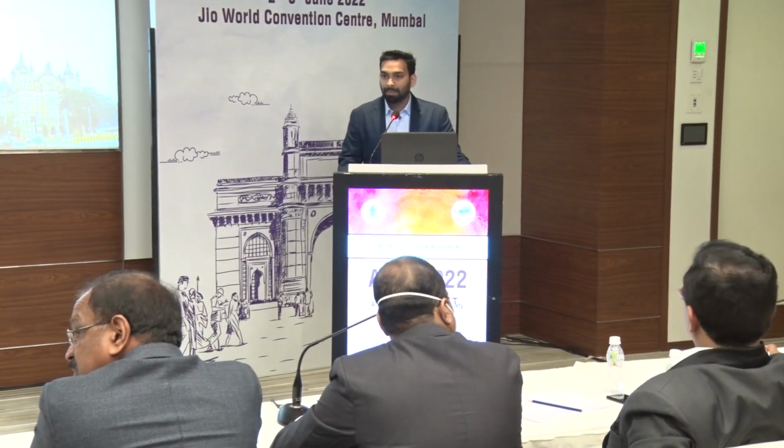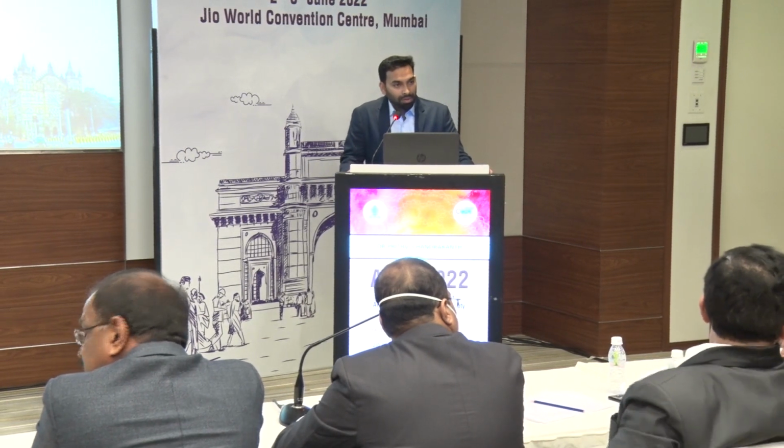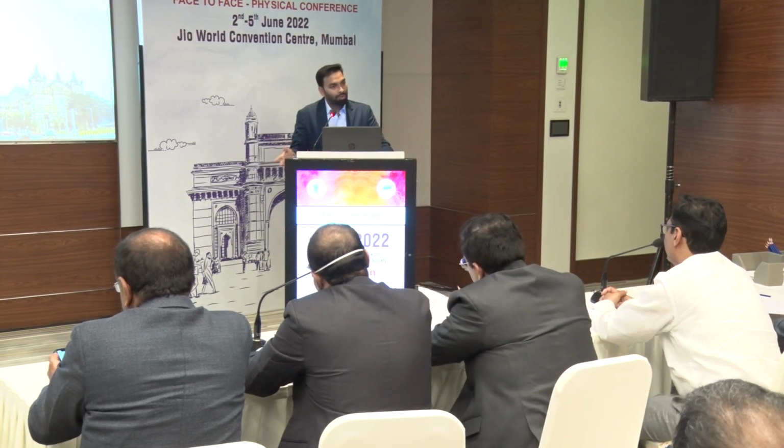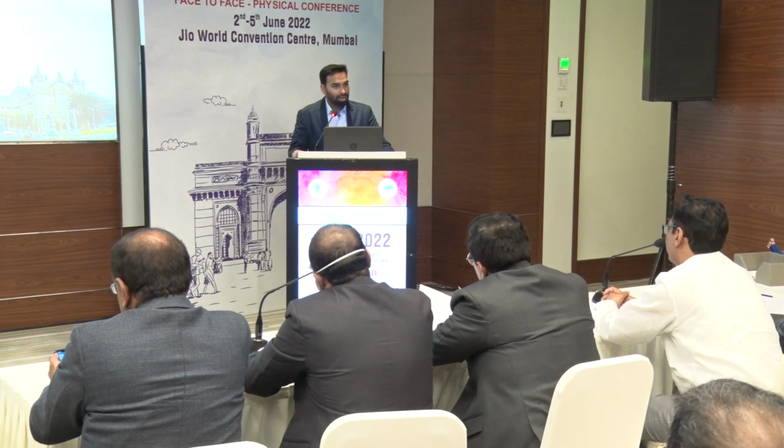Can you use ready-made available lenses, photographic lenses for mobile cameras, like telescopic lenses and all? They are available ready-made. No, not telescopic, but other magnifier lenses. Macro lenses are available, but that doesn't hold good for microscopy. Okay. Yeah, the total optics and the principle of optics totally changes when we use that kind of lenses.